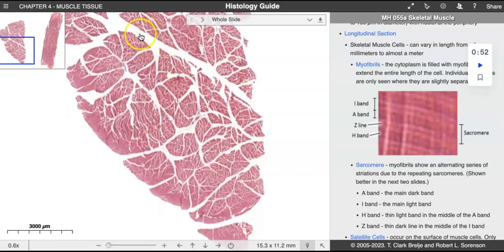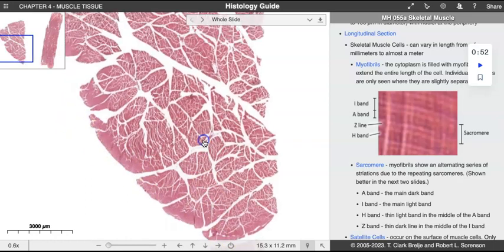So the white spaces really are the areas where our fibrous connective tissue would fill in to help support the muscle cells. At the outer periphery, if this was an entire muscle group, is where you would find the connective tissue that we call the epimysium. Epi is the outer surface, my is for muscle, and IUM, EUM is usually in reference to some sort of membrane or outer coating, usually cellular, like epithelial and connective tissue.